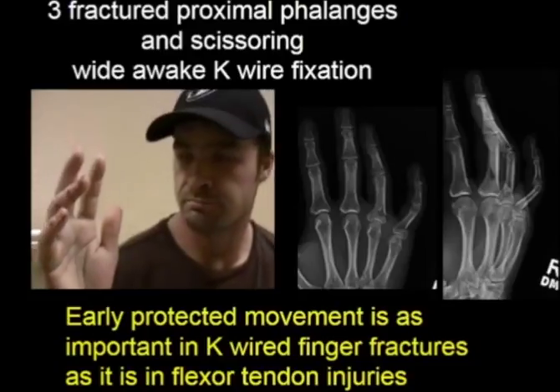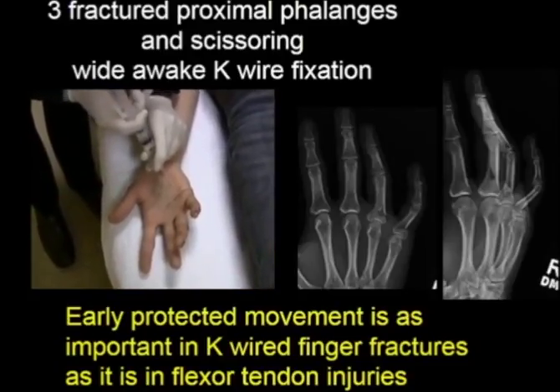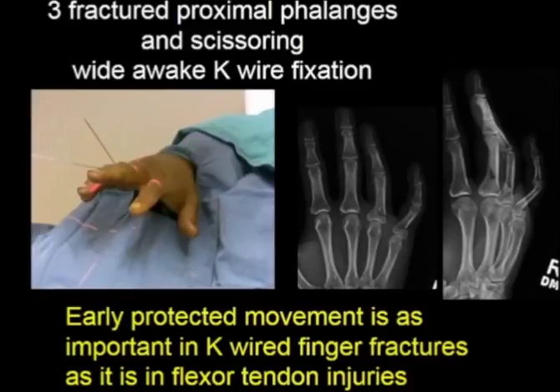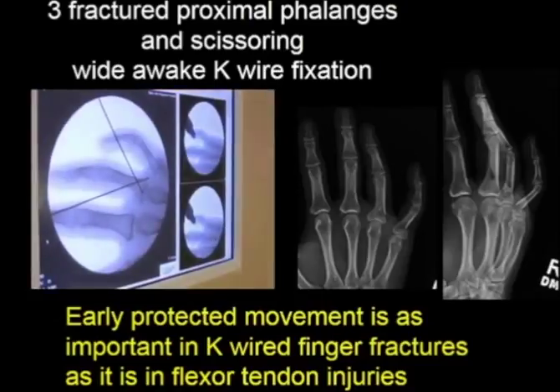This patient has scissoring of his fourth and fifth fingers from fractured bases of the proximal phalanges. We inject the local anesthesia very slowly and numb both fingers, and then insert K-wires.